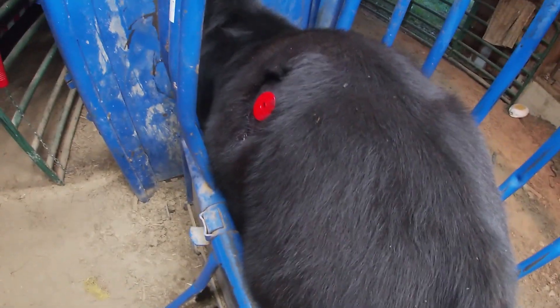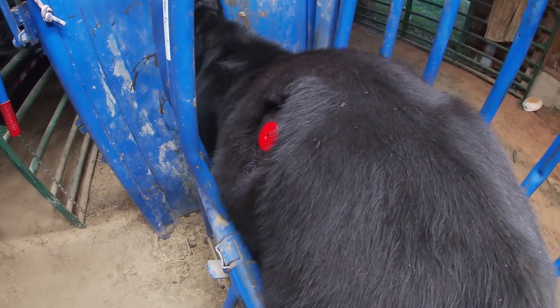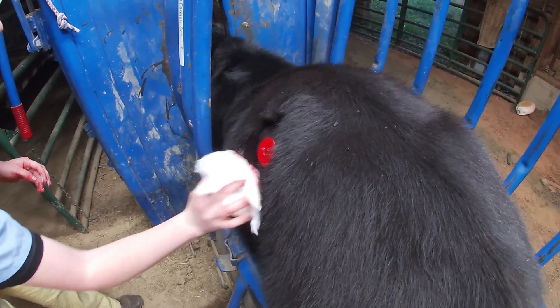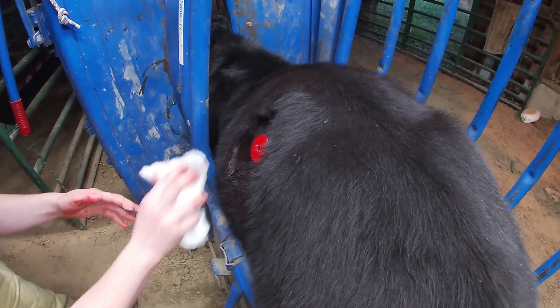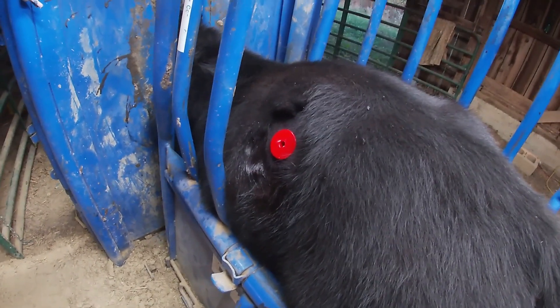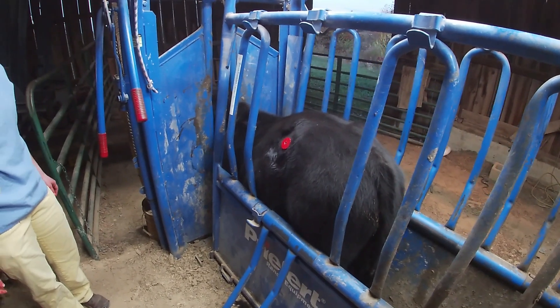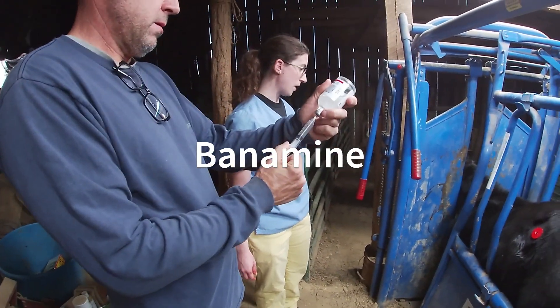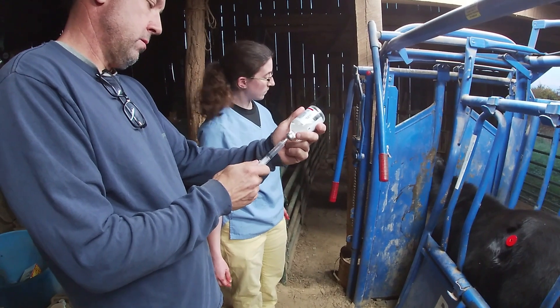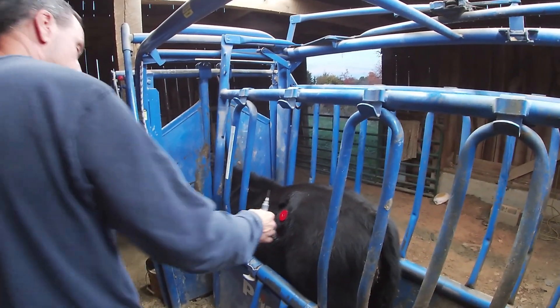Do you recommend sending him out or try to get him up with his mama tomorrow? Ideally keep him in a smaller area where you have better access in case you need to grab him, so you can keep an eye on him and make sure he's still doing well. The trocar shouldn't come out and he shouldn't pull it, but it's always nice to monitor. For medication dosing it's about 1ml per 100 pounds, so around 5ml for this calf at roughly 450 to 500 pounds.